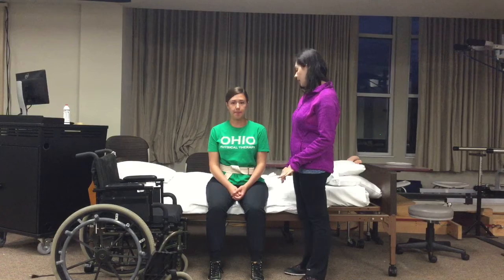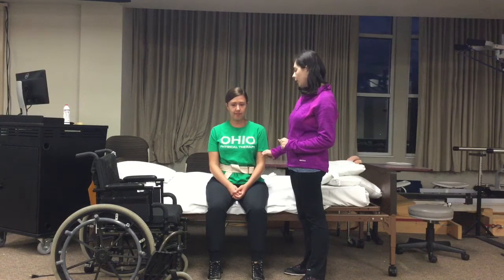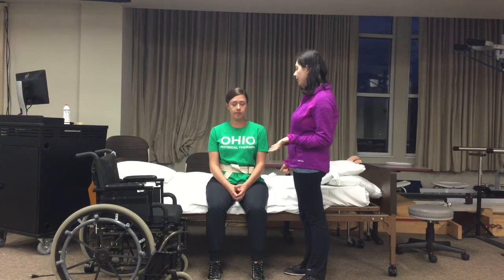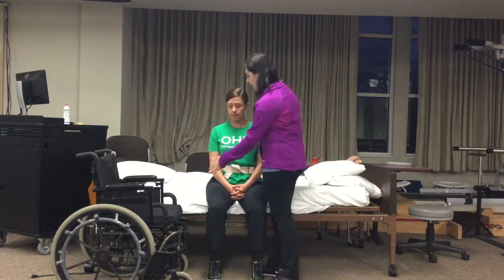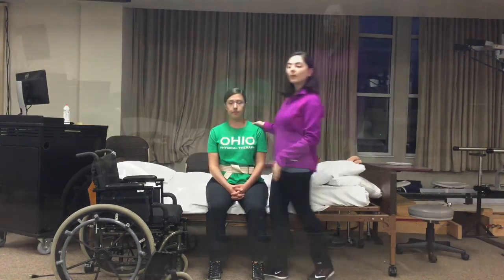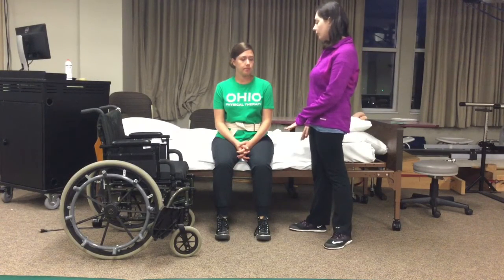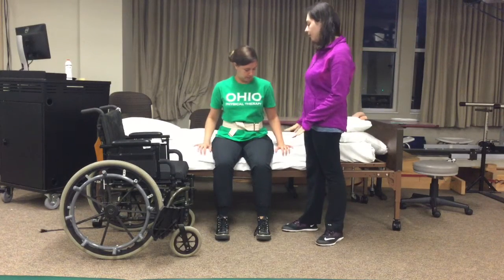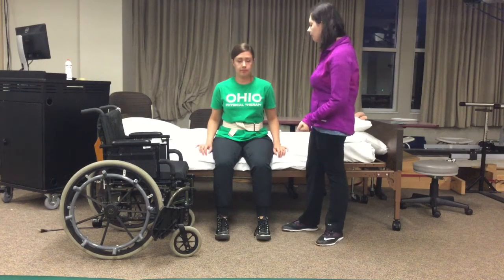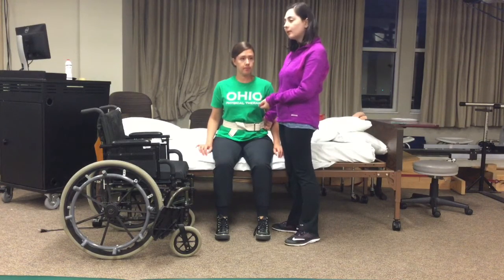They need to be stabilized, so you may either put the weight belt, gait belt on them, which I'm going to use, or you can also stabilize them by placing one hand on the patient's shoulder and the other hand on the patient's hip. Since the patient is not dependent in this skill, she is going to help herself raise by pushing off of the bed using her arms. And I'm going to help stabilize her by grasping onto her gait belt.